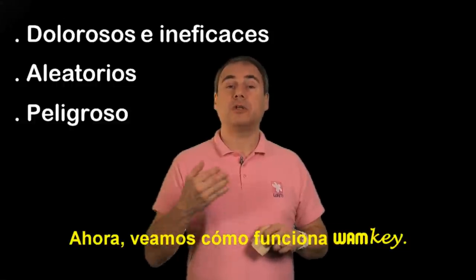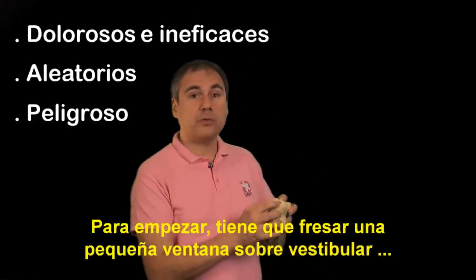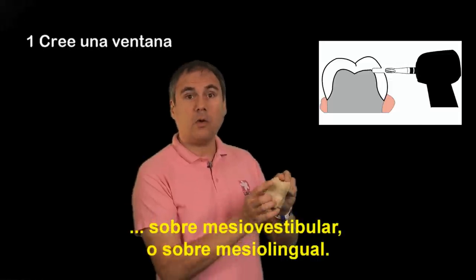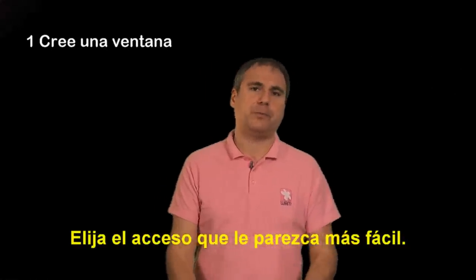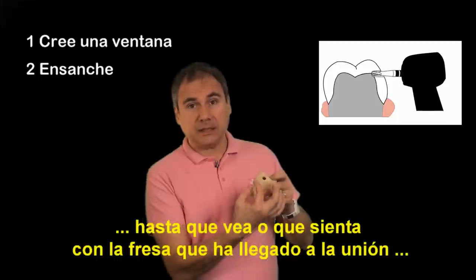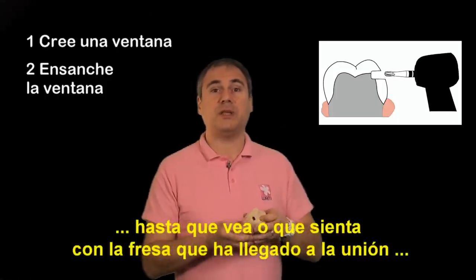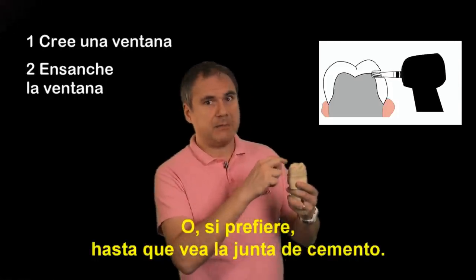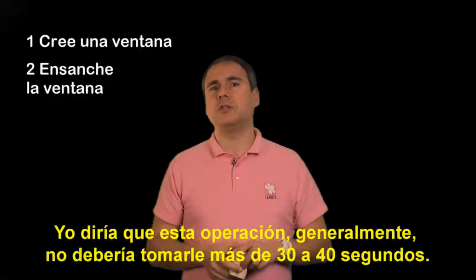So let me now show you quickly how to use the WAMkey. First of all, you are going to drill a little window on the buccal, the mesiobuccal, or the mesiolingual side of the crown — just choose the easiest access for you. Then you are going to enlarge this window slowly until you can see or feel with the bur that you have reached the junction between the prep and the crown, or until you can see the cement line.